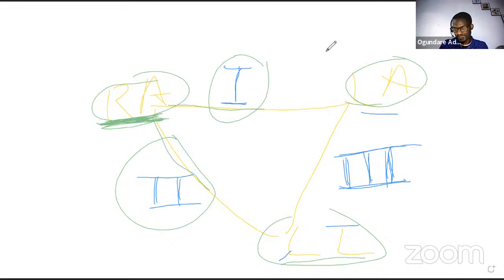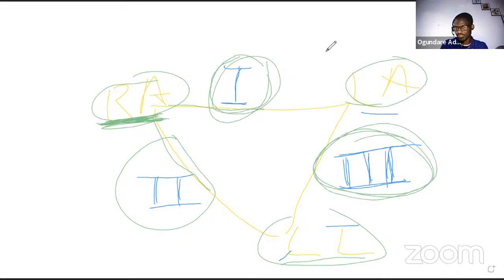If there are artifacts with lead 1 and lead 3, then you need to adjust your LA, the electrode on your left arm, because this is the one that gives birth to lead 1 and lead 3.